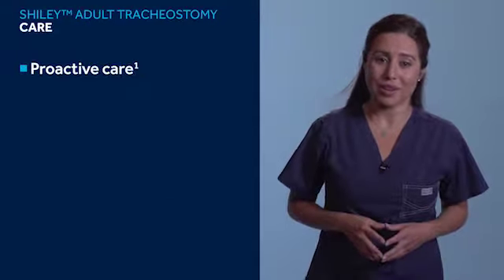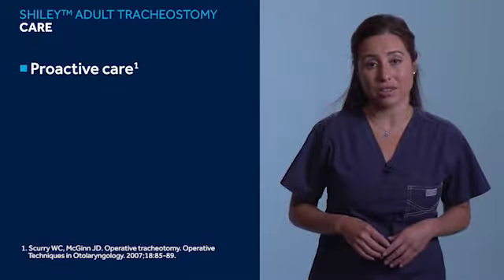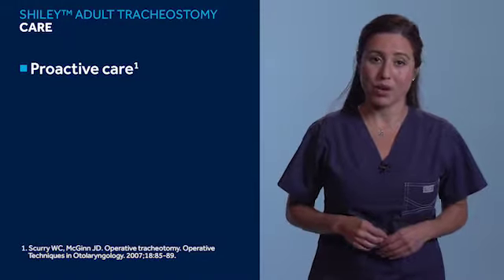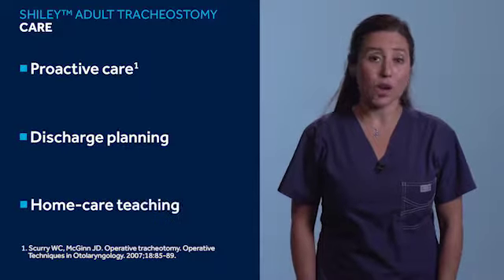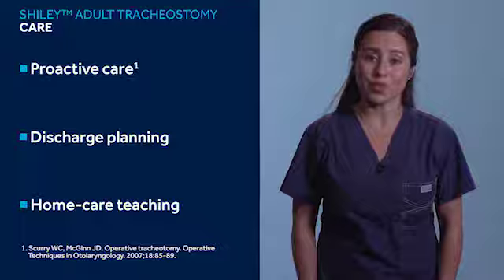Proactive tracheostomy care can reduce the risk and occurrence of postoperative complications and promote positive patient outcomes. Coordinated discharge planning and home care teaching will help to successfully transition the patient from hospital to home.